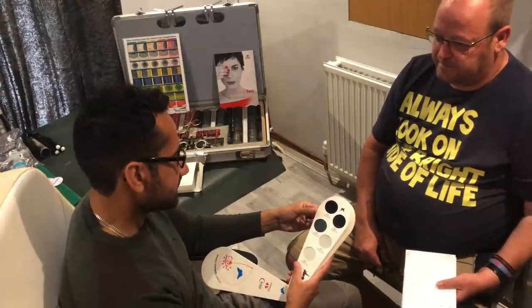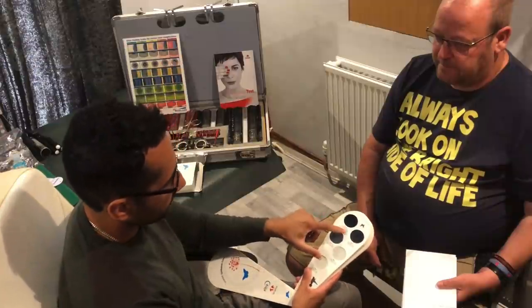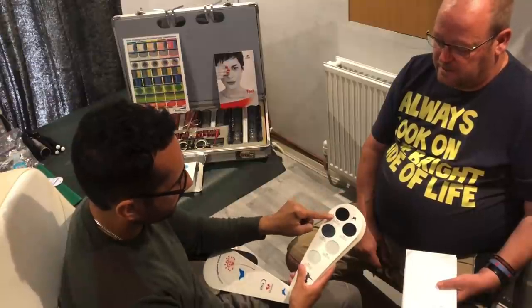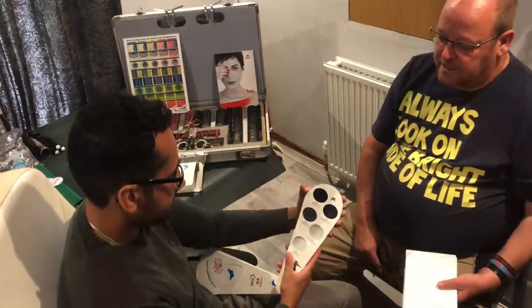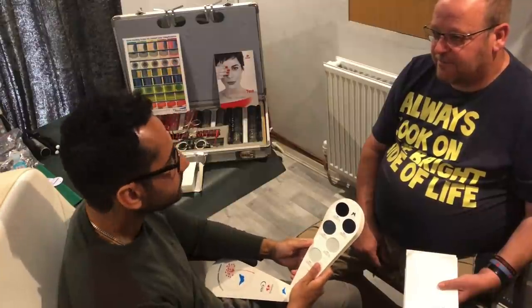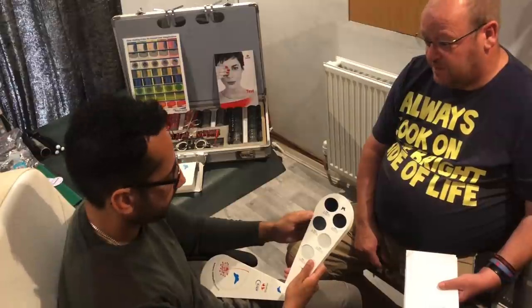I think if I select a dark pair of frames, then I'm looking at something like the 50-50, I feel. I just think this is too dark. Similarly with this one, the 75% absorption. I like the 50-50. In a lot of cases, they recommend that you have a lens colour to suit the colour of the frame that you've had.